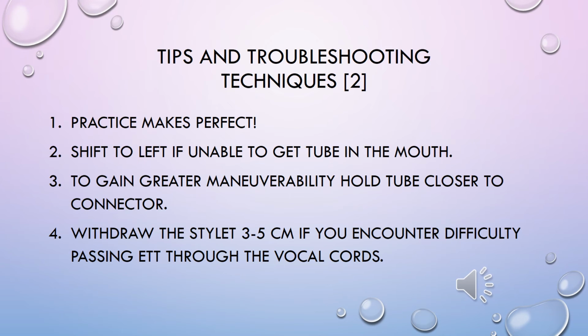Here are some tips and troubleshooting techniques to hopefully help you with your Glidescope intubation procedures. Remember, practice makes perfect, meaning use the Glidescope for your easy and routine cases until you're very comfortable with it. That way, when you are in situations where you have a difficult airway, you will already be familiar with the mechanics of the device. Also, if you experience some difficulty in inserting your tube, shift to the left. I know it says you're supposed to stay midline, but it's okay to shift to the left if you're having trouble getting the tube in the mouth.